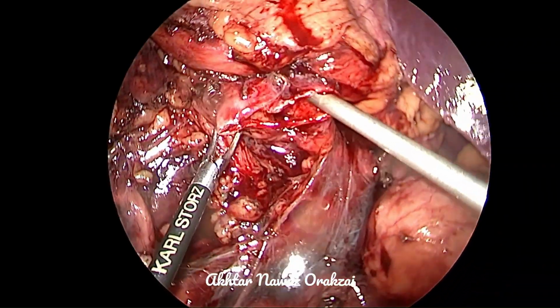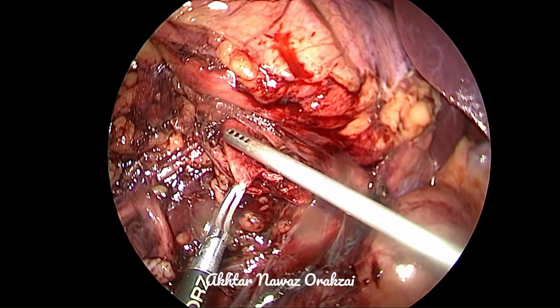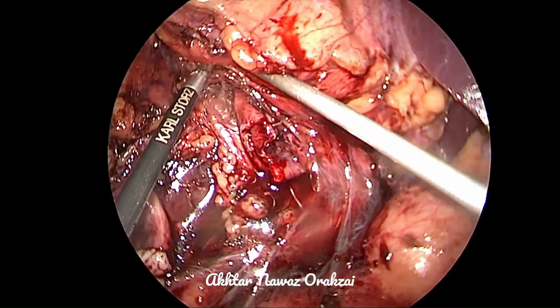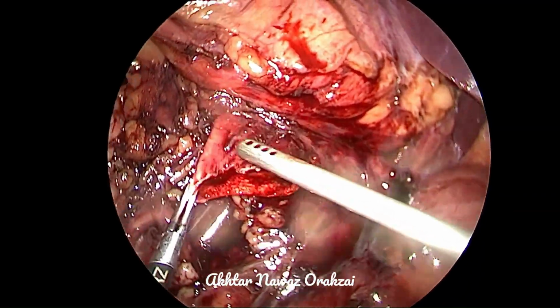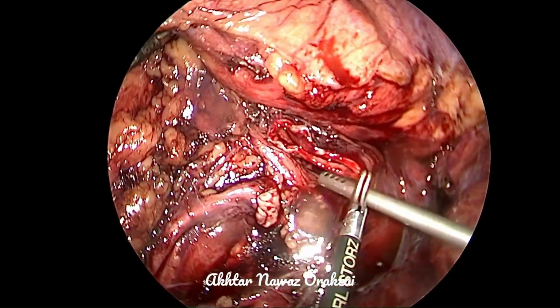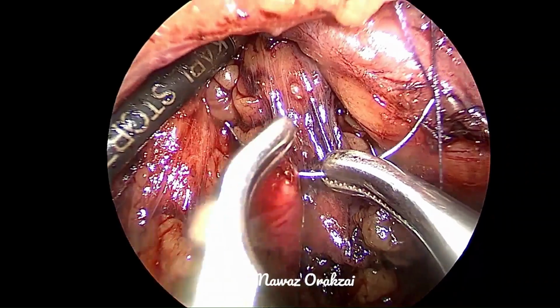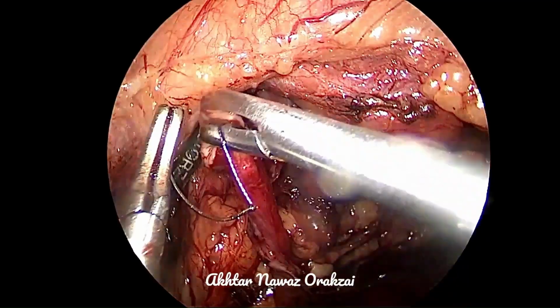Here you can see that we can very easily come across this segment. The length of this segment is extremely important. You should not cut it like this, otherwise the ureter will be anastomosed very near to the pelvis, and when you leave it, the ureter will go and get stuck to the lower pole of the kidney. But here you can see that the length is enough. Even if we release it, it is not getting stuck to the lower pole. So in secondary PUJ obstructions, the pyeloplasties that I have seen which have failed have been because of resection of this segment of the pelvis.